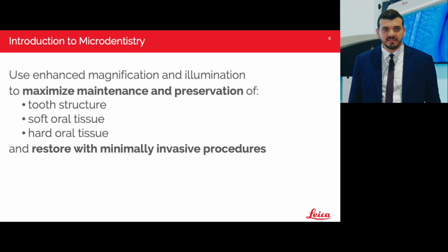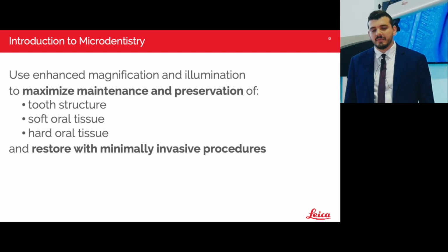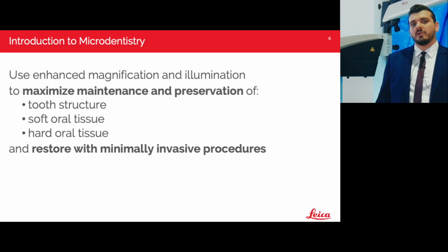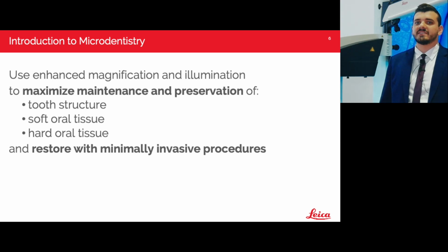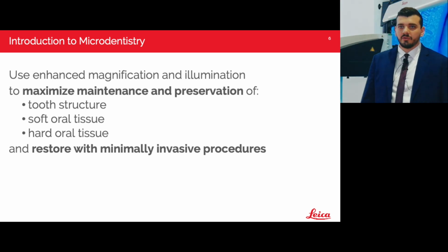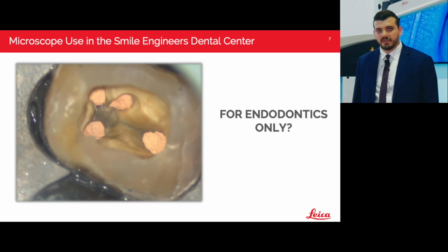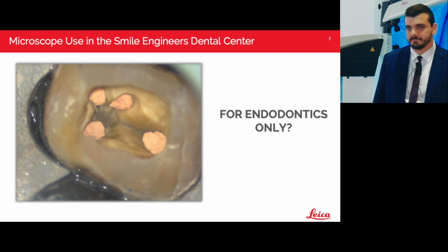So, the microdentistry is utilizing enhanced magnification and illumination to maximize the maintenance and the preservation of soft and hard oral tissues and tooth structure and preserve it with minimal invasive procedure. Moving to the uses, is it only for endodontics? To answer that question, let's see this video.